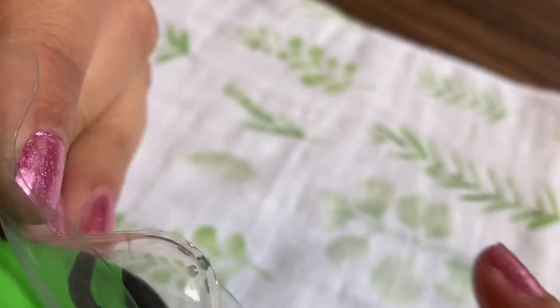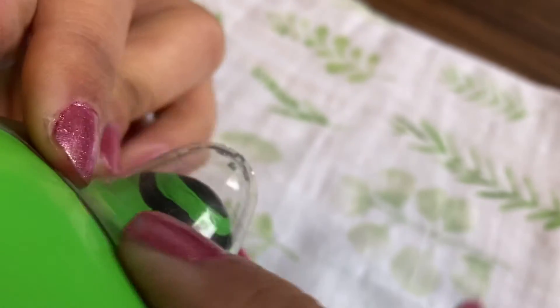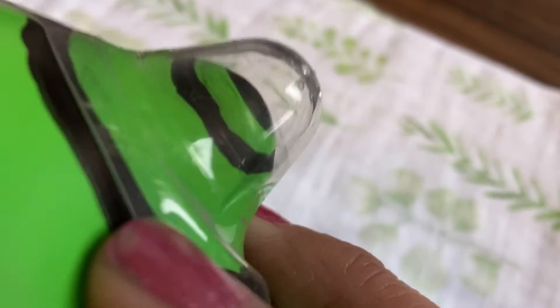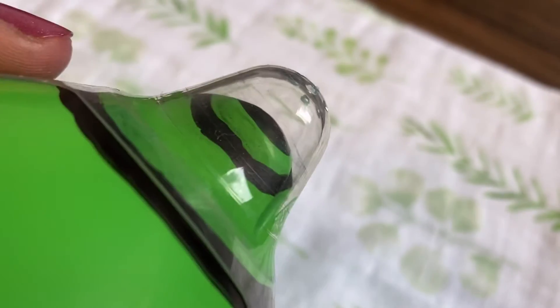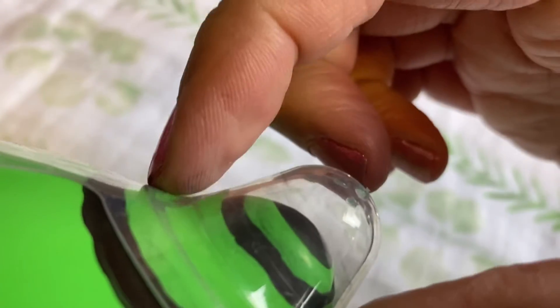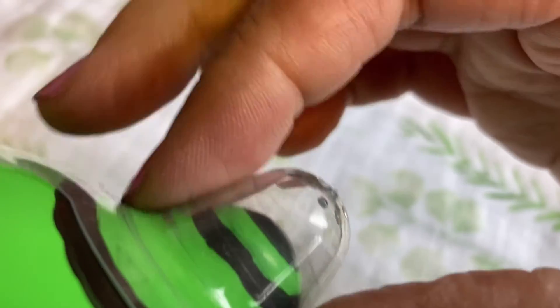When your baby latches, their lips should be flared out so that their gums can land where the nipple shield shaft starts to angle at the wings of the shield. If your baby's gums are any more shallow than that, they can start to pinch the tip of the nipple, which hurts and prevents enough milk from coming out.